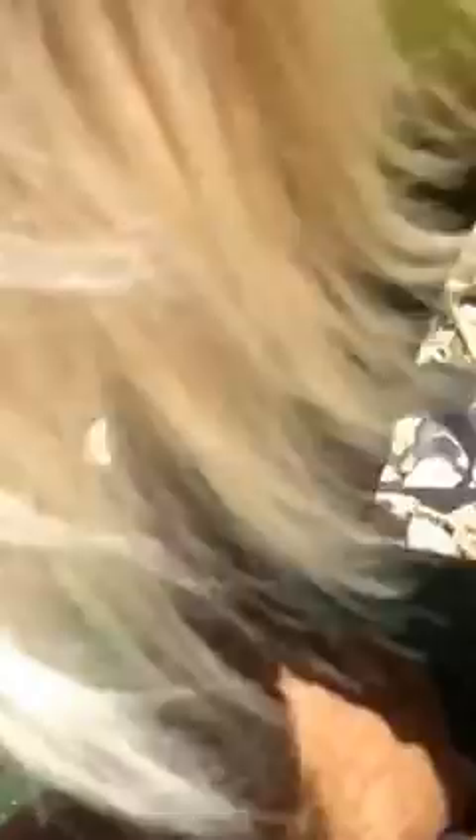Then check and make sure that these two bones under here are sitting nicely in the stirrups. You can use his tail to reposition him if you need to. Take these two straps — sometimes they scoot back, so you'll need to bring him up a little more to the front. And fold it over him like so.